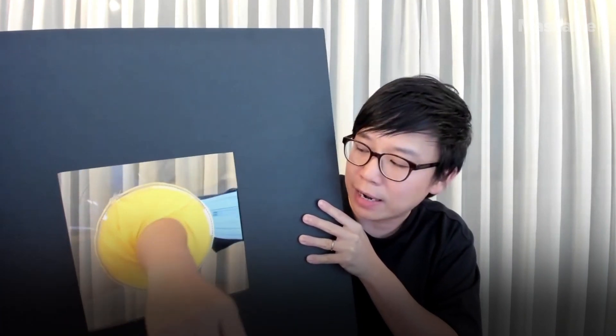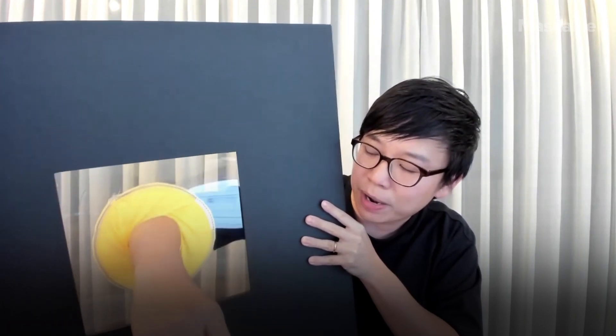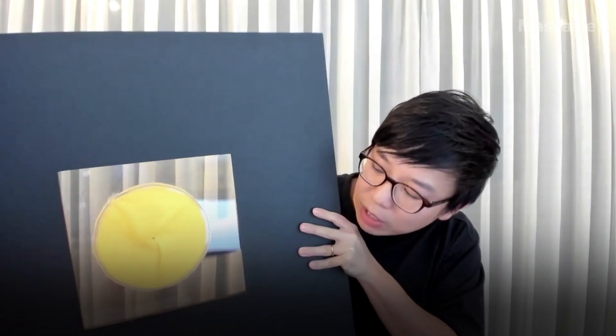If you look at the boundary between my hand, my arm and the yellow part — when you pull out, it closes quite quickly.